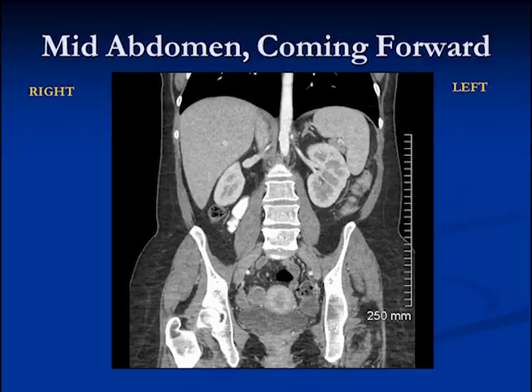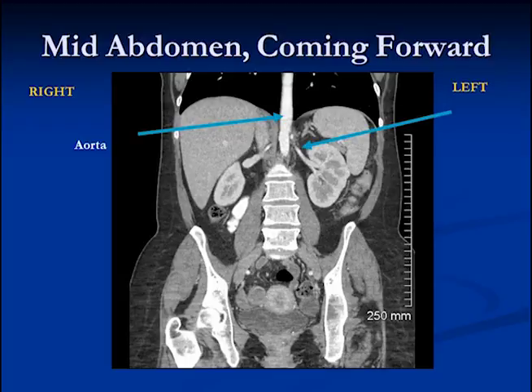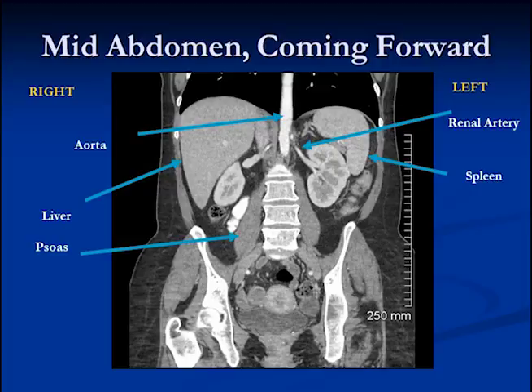If we move a little bit forward into the mid-abdomen, things change again. Here we can see the aorta, which is a retroperitoneal structure sitting behind everything else. We can see the renal arteries going down from the aorta into the kidneys. There's the liver again, there's the spleen, and again these are the psoas muscles on either side.